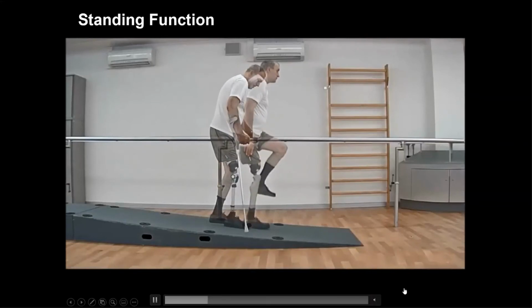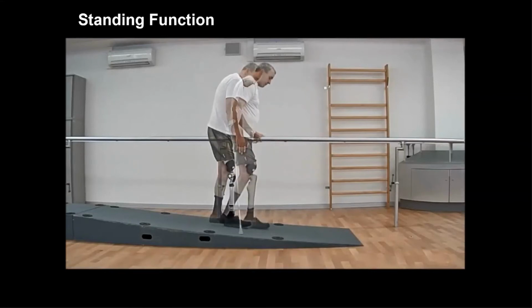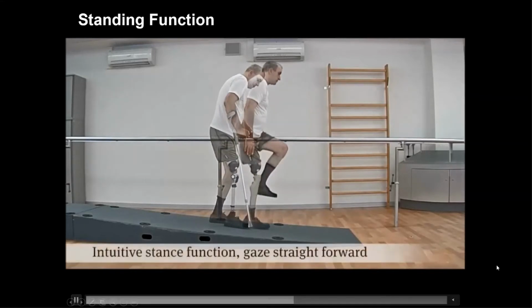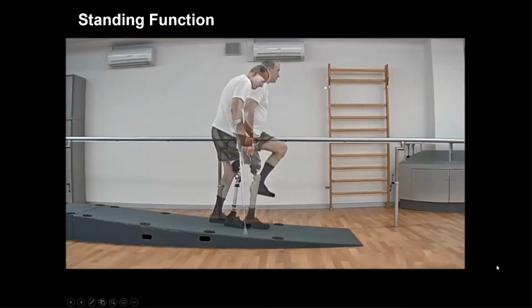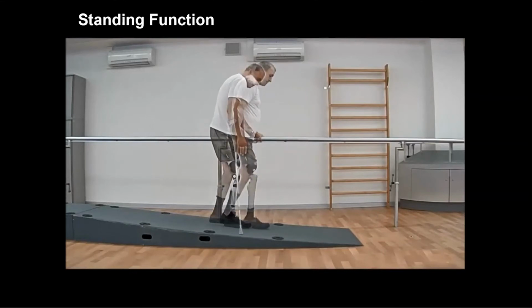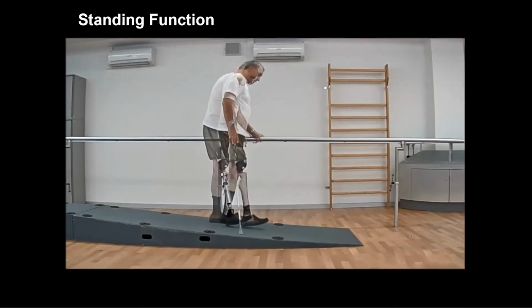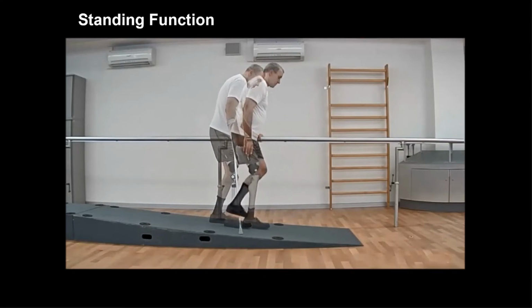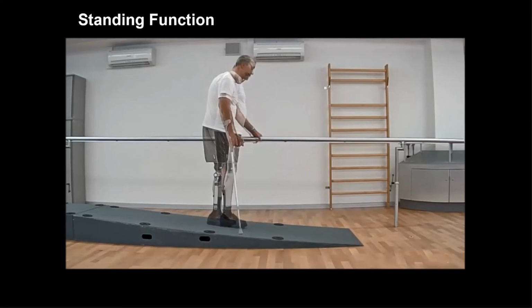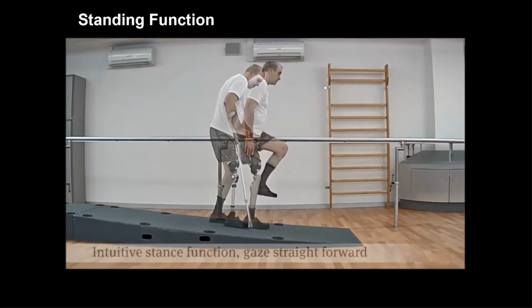Next slide, Dr. Kannenberg. And then in the C mode, we have the ability of the standing function. So here you can see a comparative video of a single axis stance control knee versus the Kenevo, and the individual standing on a bent knee, and it has that intuitive stance feature built into it, whereas the weight-activated stance control knee becomes unstable for that user. And you can see how they have to look down on the ground, where on the Kenevo they can stand on that one leg and it is in that lock position for them. So very nice feature for those individuals that progress to that mode C. Next slide, Dr. Kannenberg.